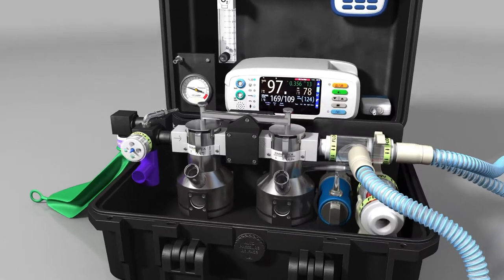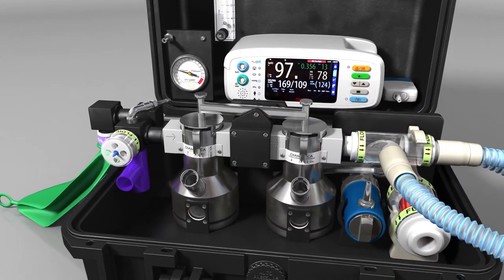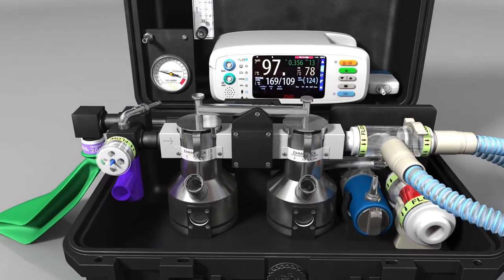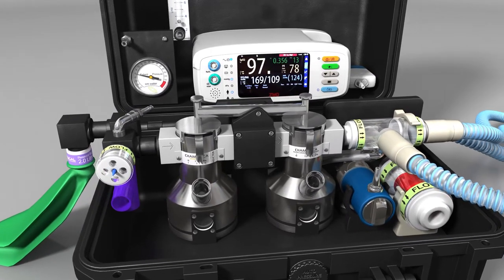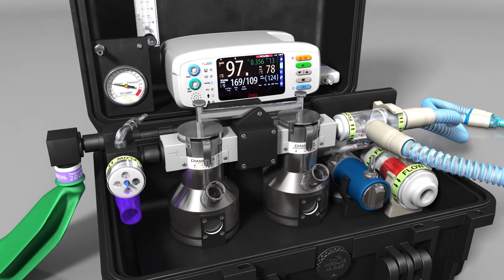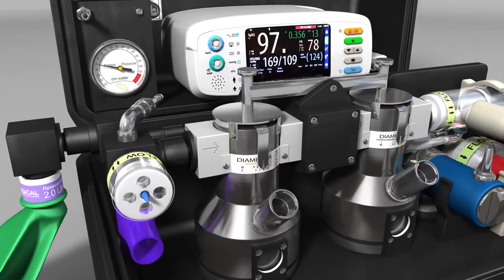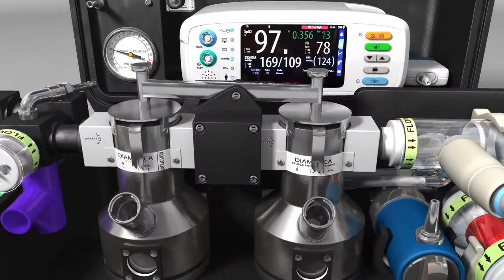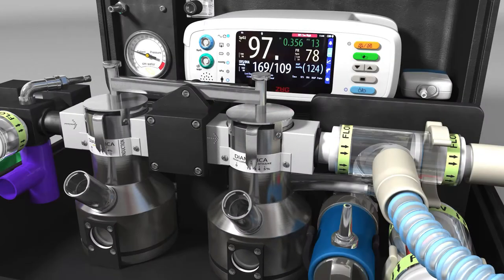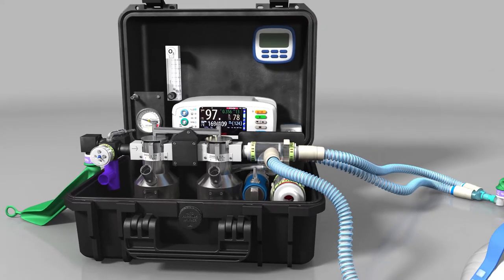The DPA Duo is supplied with two vaporisers that are suitable for sevoflurane and either halothane or isoflurane, to maximise the resources available, making the DPA Duo an ideal anaesthesia solution for low resource health systems. The dual vaporisers permit the safe delivery of a gaseous induction using sevoflurane before switching to isoflurane or halothane, allowing the anaesthetised state to be maintained at an economical rate.